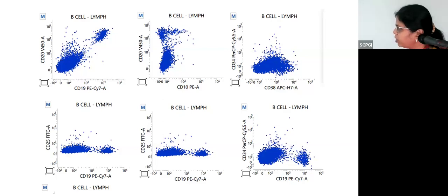It would have been TDT, I think, but I have missed that. TDT was also negative. And here again, CD34 is negative.